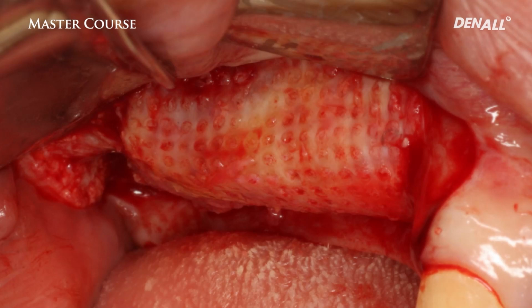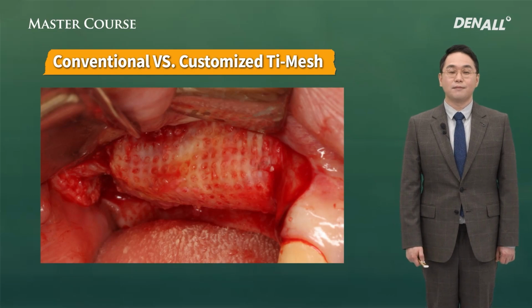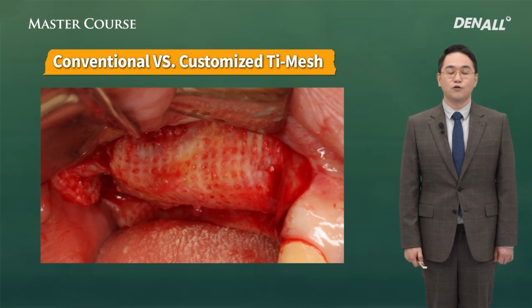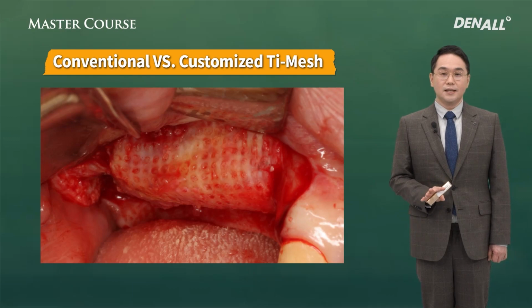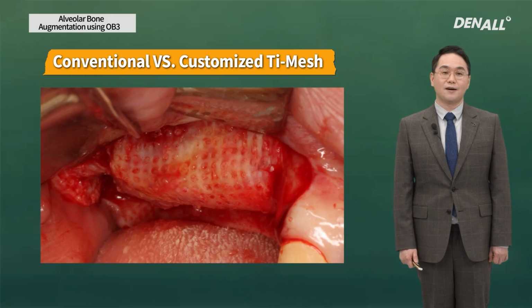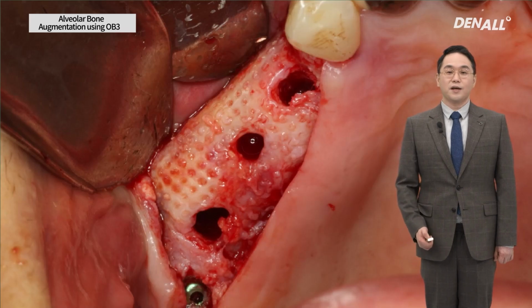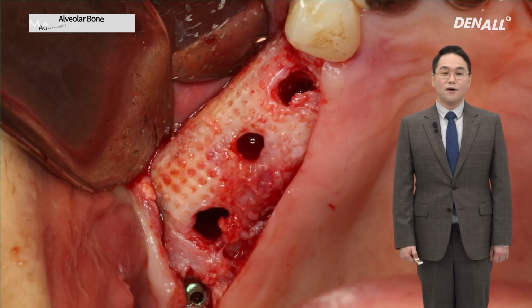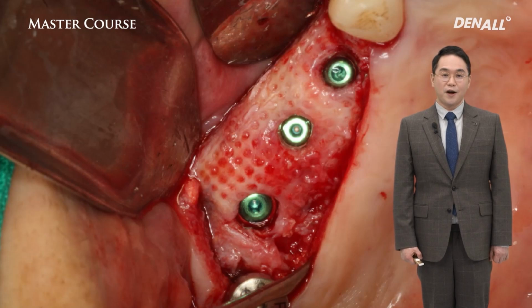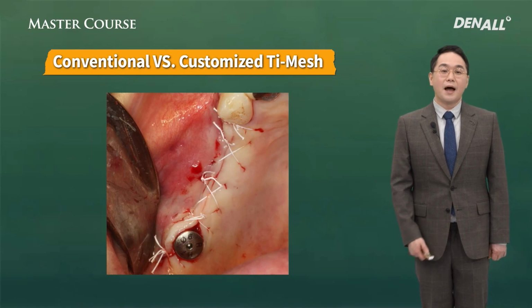After 5 months, even though bone regeneration is sufficient, the regenerated bone is still not matured, so the pattern of the bone marrow is unstructured, and therefore undersized drilling is recommended. Still, the remodeling process is going on, so the implant should be placed rather deeply, not 1 millimeter but 1.5 millimeters below. Cover screws are connected because the stability is not satisfactory and the primary closure is done.